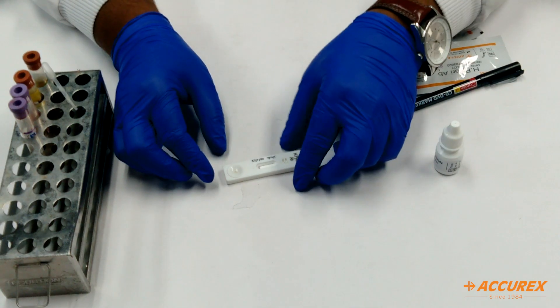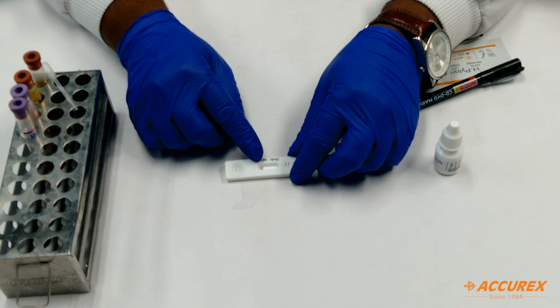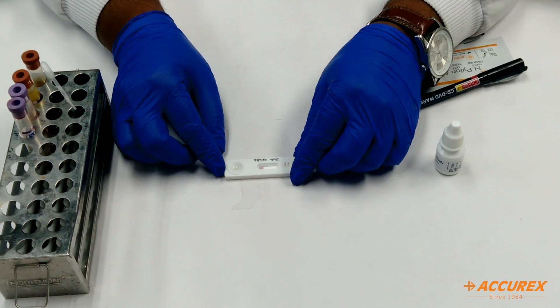You can see the process has been started. It will take 15 minutes for completion. Once it is done, we will see the result.